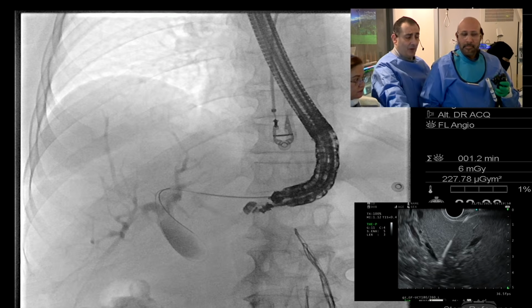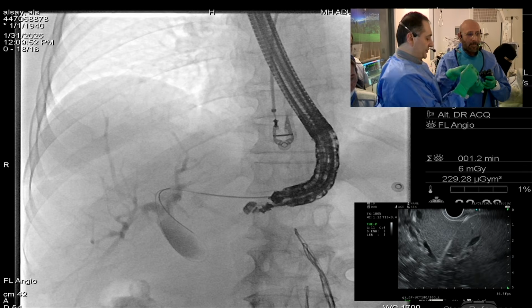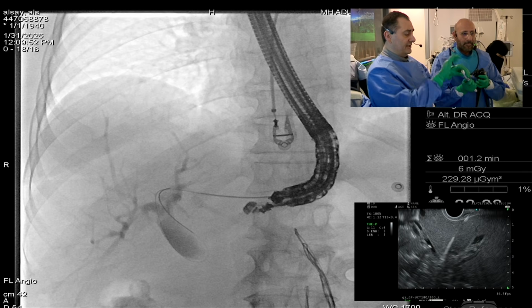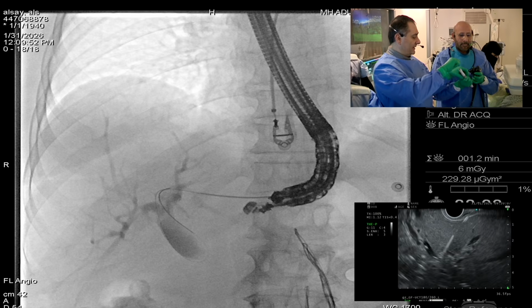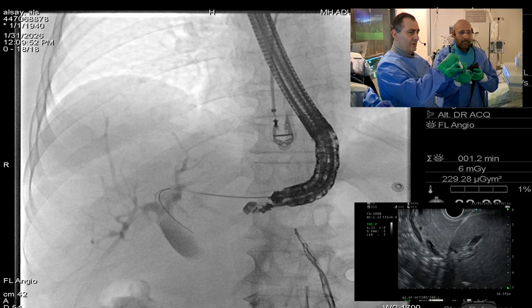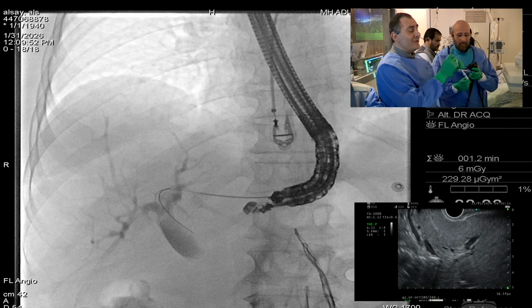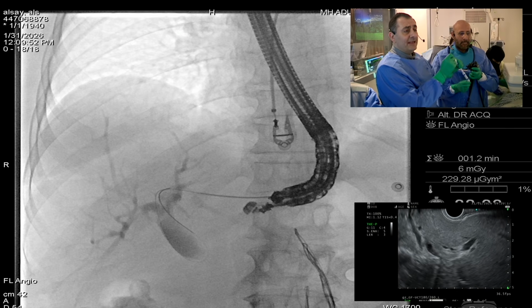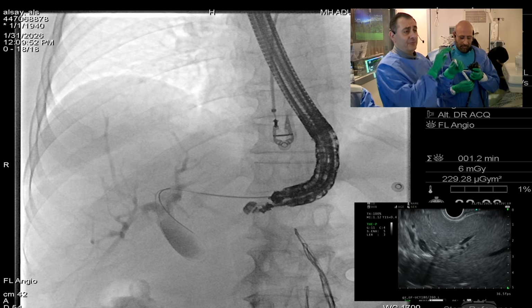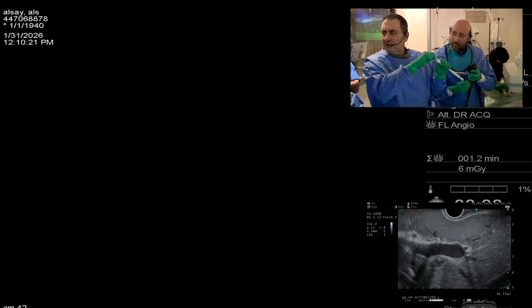So now what we're going to do, I'm going to do an exchange with Dr. Asharqi. You have to remove the needle from the biliary tree. Okay, I have the needle, the wire here. Okay, you have to remove it. Is there minimal biliary system dilatation that allows you to do HGS? Well, you can inflate, if you can get into at least a 2 millimeter branch, you should be able to. X-ray, slowly, X-ray.